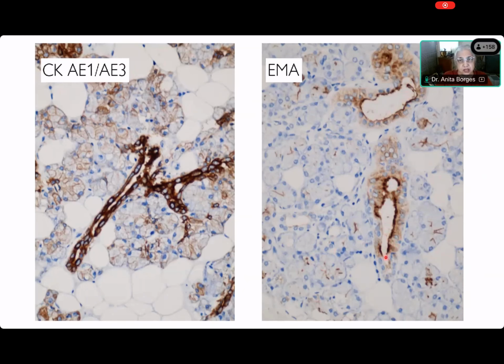You do immunohistochemistry, Gaurav? Yes, ma'am. All right, now you just look at this left-hand side picture, and you tell me what you notice. This is cytokeratin, standard routine cytokeratin. Anything you want to comment upon? What do you notice here? Here you have the ducts and you have the acini. Come on, tell me, what do you notice? The ducts have been highlighted over here, ma'am. Epithelial, yes, ma'am. And you think the acini are not epithelial, Gaurav? Are acini epithelial?